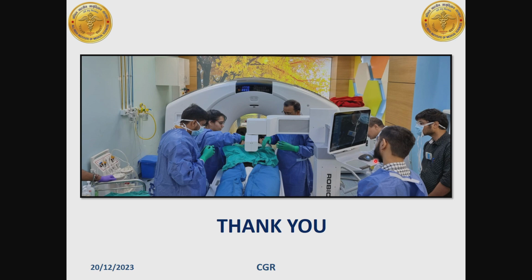The radiologists have been using the PET images for PET guided biopsy. What they do is visual registration. They have the PET image and a CT image. That is one method. The other method is software based registration. But as she said, it's not real time based. That is the difference. But this procedure has been done without this robotic arm or anything. It was being done with radiology, and they still do it. Many centers are doing it.